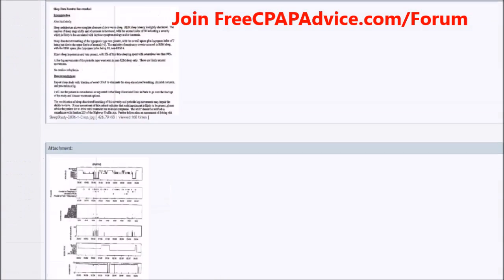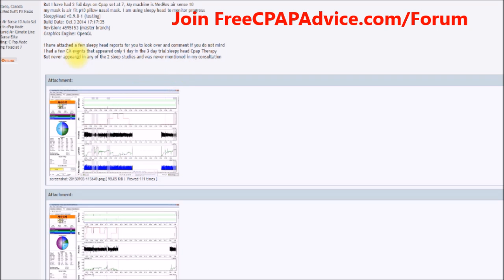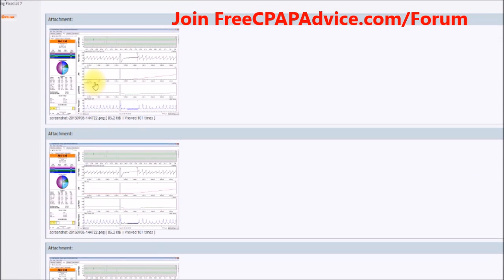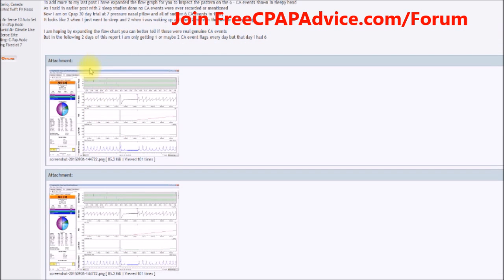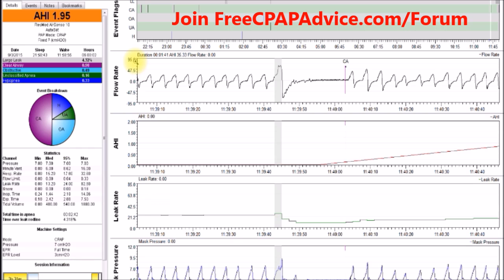We have a person on the forum asking about central sleep apnea and how you know if it's real when looking at a SleepyHead report. They've attached some SleepyHead printouts. They're seeing six central apneas tagged by SleepyHead that were not even recorded or mentioned in the report they got from their doctor.